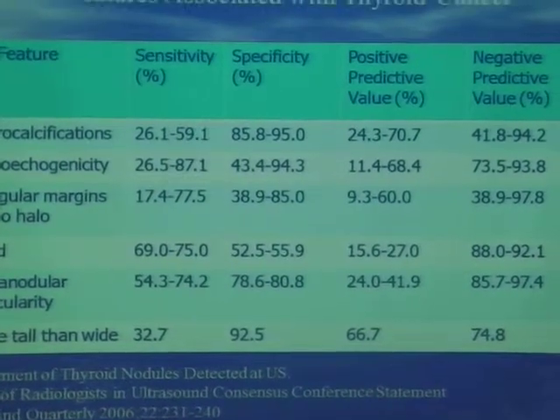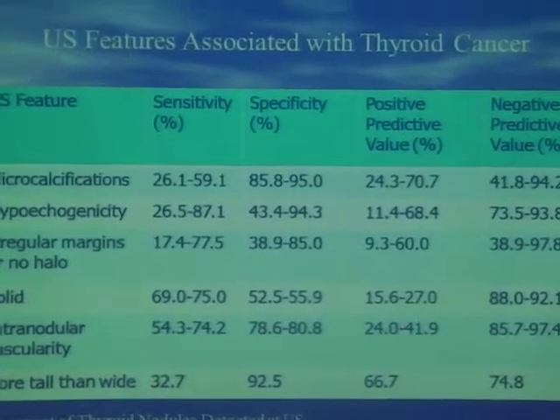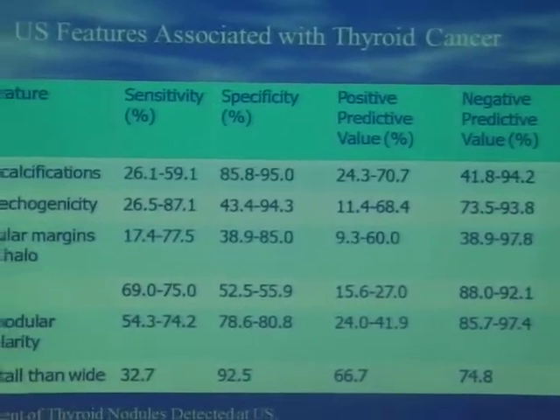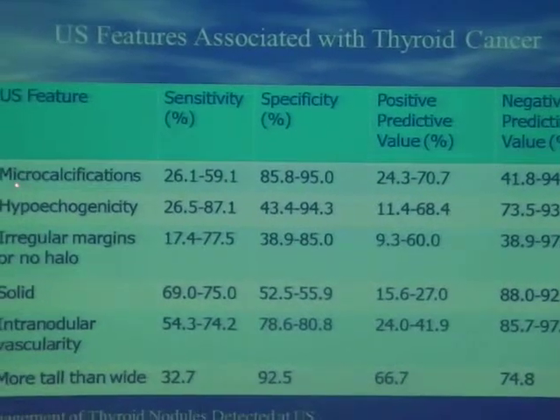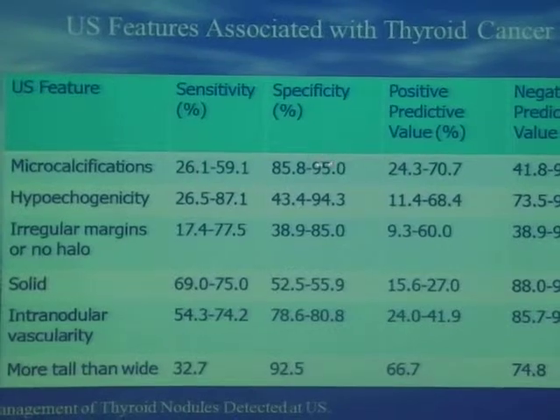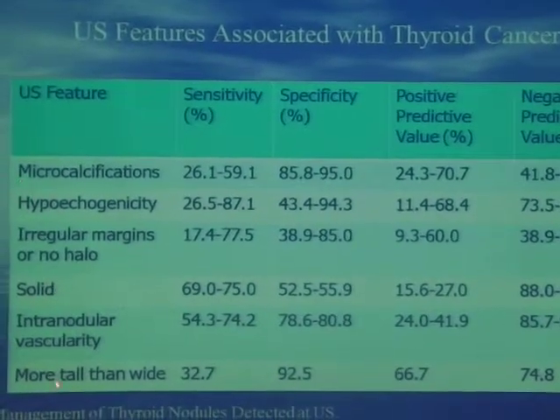So I was just looking at this, and I think it will be interesting. I'll pass it to Alex, and maybe he can get this over to you all to read and have a look. This is taken off a paper, which was a consensus that was done to look at the different things that you see on ultrasound and its sensitivity, specificity, and positive and negative predictive values as far as all these things are concerned.